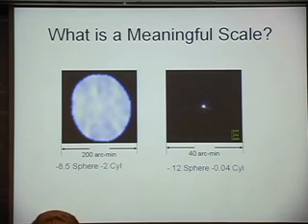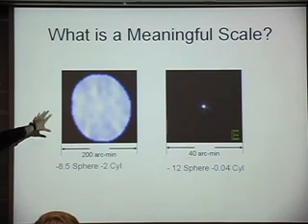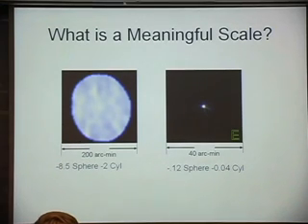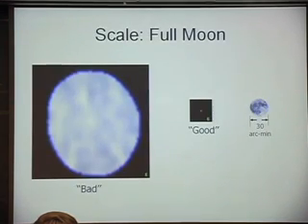And so one of the things that's hard to grapple with here is the sense of scale. This is someone with bad vision, not terrible. There are probably people in the room with worse vision than this. And here's someone with good vision, a little tiny bit of sphere and cylinder and some of those higher order aberrations. I've got the E in each of them, but if I put them on the same scale, you really get a sense of what life is like.